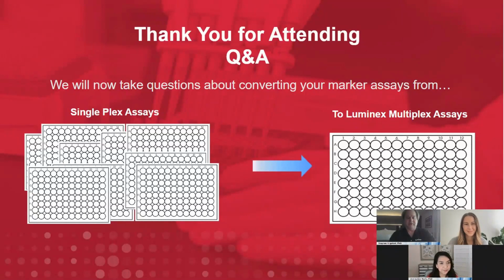Yeah, I can add to that as well, because especially for a lot of the proteomic assays, where you have a cell lysate or something like that for sandwich capture, or if you're doing a serological assay, like we've been doing a lot of these, putting various antigens on a bead. You want to see if there's an antibody titer to a certain pathogen, COVID, a lot of that lately, of course.